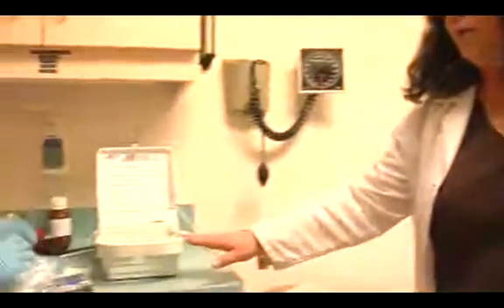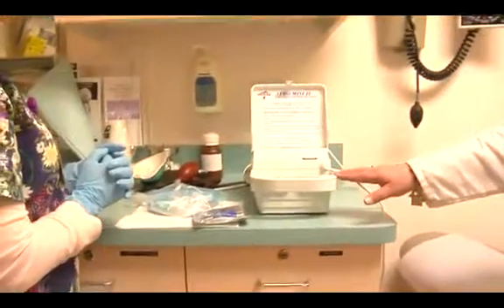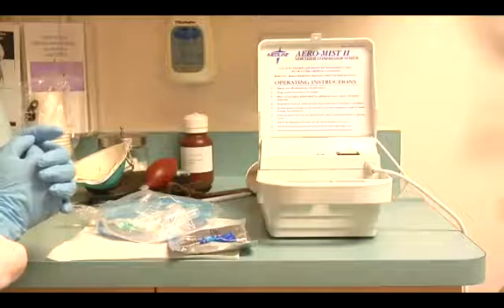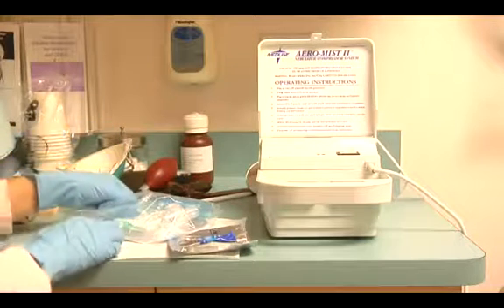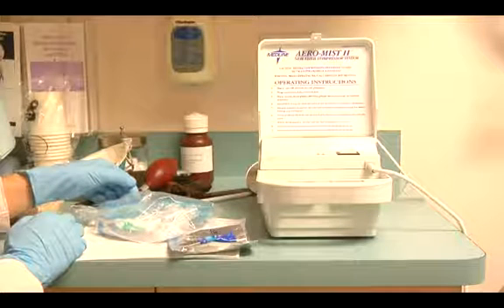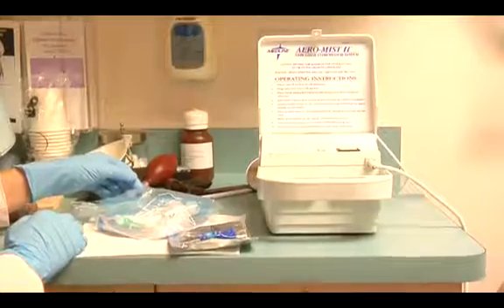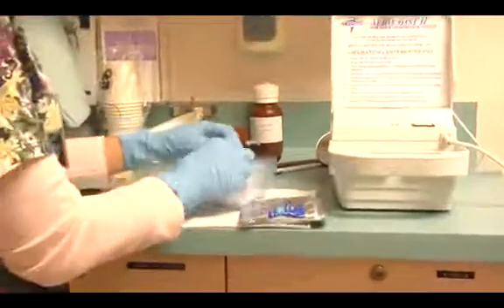We're now going to demonstrate how to use a nebulizer. This is the nebulizer machine that is available by prescription. We also use tubing which does need to be cleaned on a regular basis. But we're starting with a new set of tubing, which we're going to open up the sac.